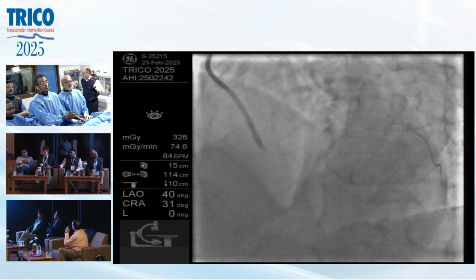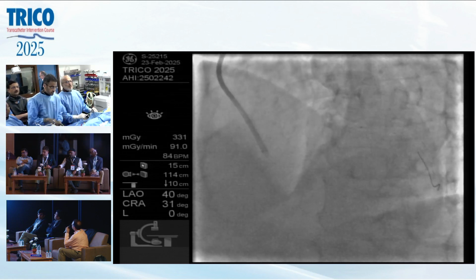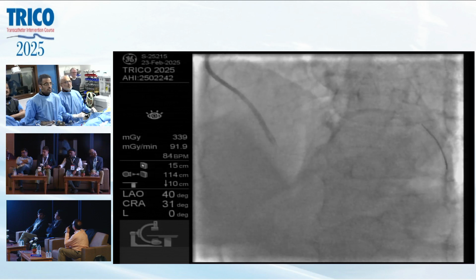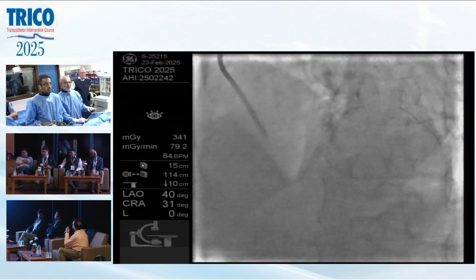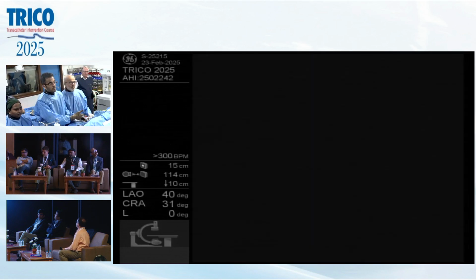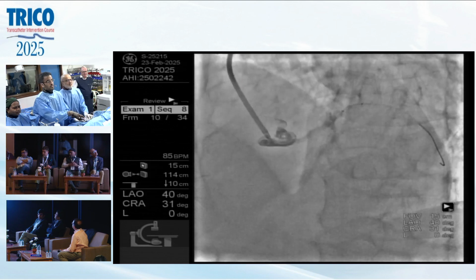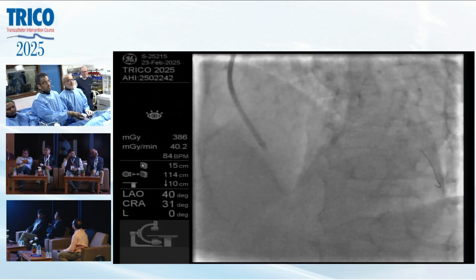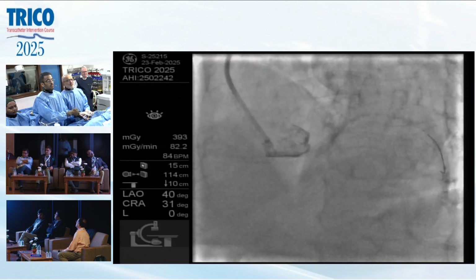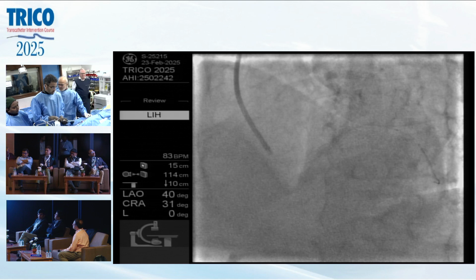Okay, this is better. Now we should coaxial, right, coaxial. Shall go up, yeah. Go, 6. 6. Okay, deflate and see. Where is the... I think this is better. This is the distal part of the lesion. I think so. Yes. Then go 6. It's a soft lesion. No problem.